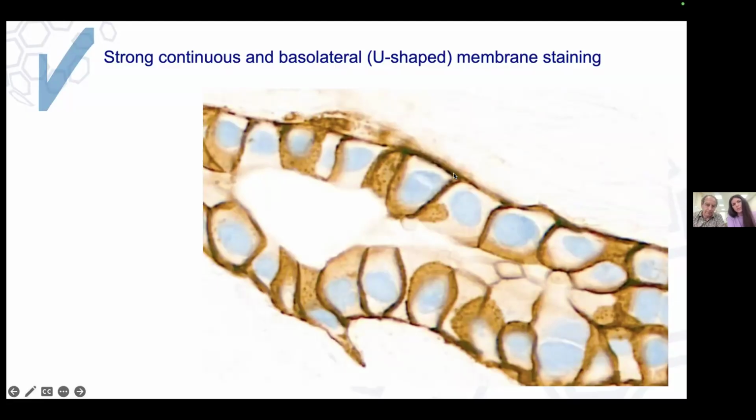Is it possible that some of this is because of the thick membrane staining or a lot of protein? When you look at the in situ hybridization, you see that there are sometimes hundreds of genes in these cells, and you don't know whether all of these genes produce full-length, full functional protein.